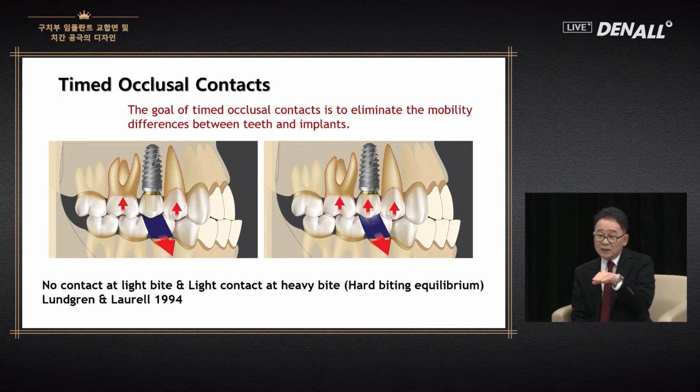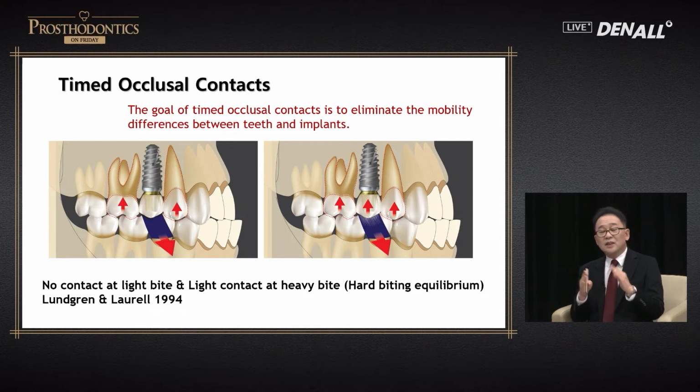We tend to focus on the axial movement, but that causes contact problems slowly. So it is not easy to resolve it with the point of contact. What I'm trying to say is that the principle and concept need to be understood, and that will help when you try to figure out some problems.